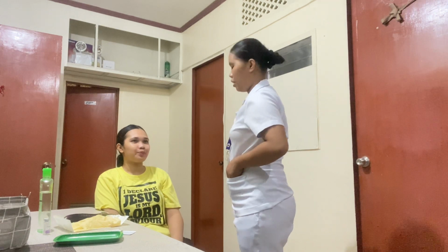Yes. Okay, thank you. And now, provide privacy to the patient to promote comfort. I have done providing my patient privacy. Now, select a site for the injection. I choose the forearm and avoid sites with lesions and tenderness to prevent infection. And now, apply gloves per agency protocol.